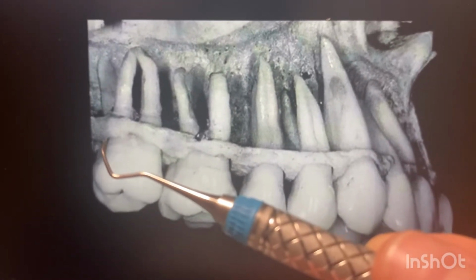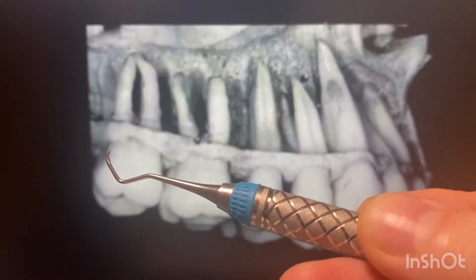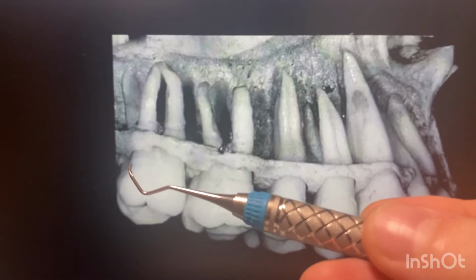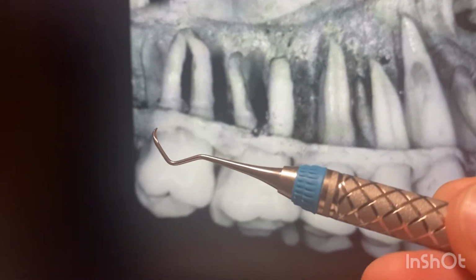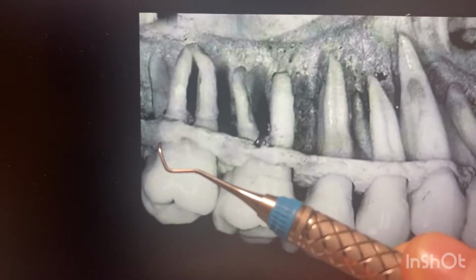Okay, to properly use this instrument, we must first close the instrument to an angle of 0 to 40 degrees to avoid any tissue laceration. This is how we're going to enter the sulcus or pocket. Once inside, you're going to open the instrument to its working angle, which is 60 to 80 degrees.